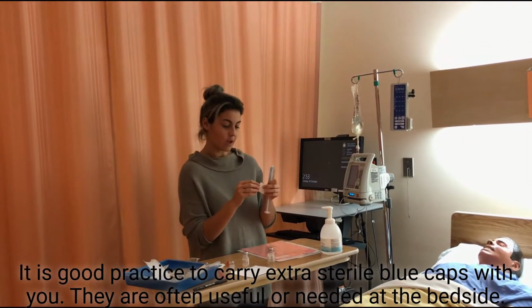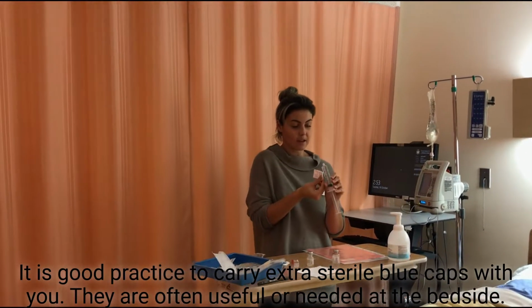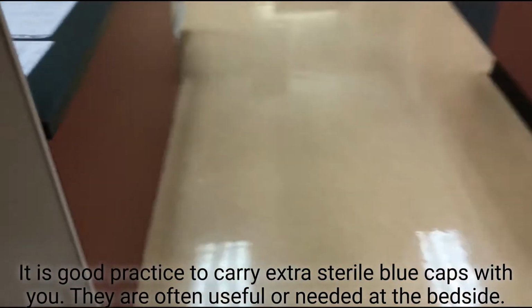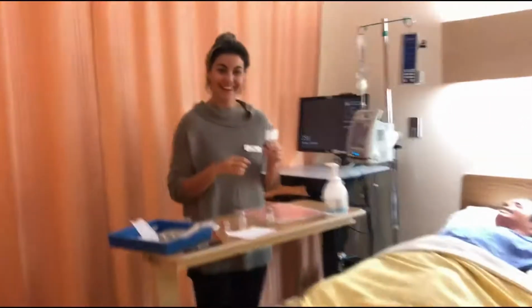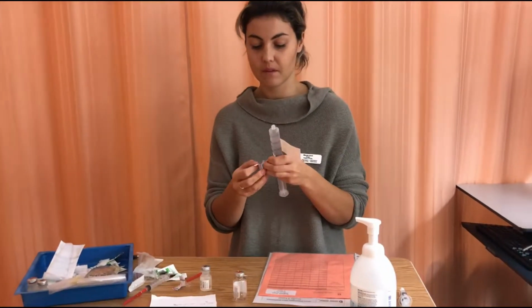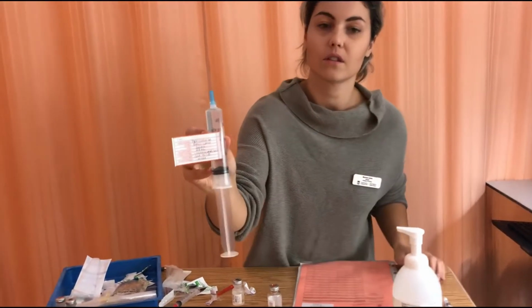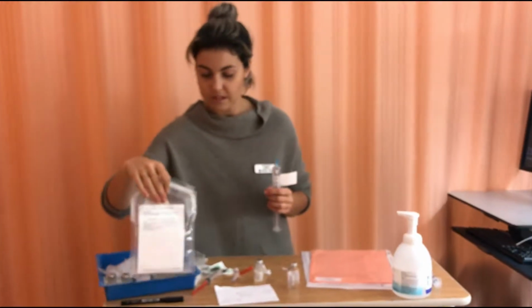And in the meantime, I'll just place my label. So I just had a nurse pass me a new blue cap, and in the meantime I put my label on my medication. And just look at my label. Okay, and then I'll be moving to the bedside.